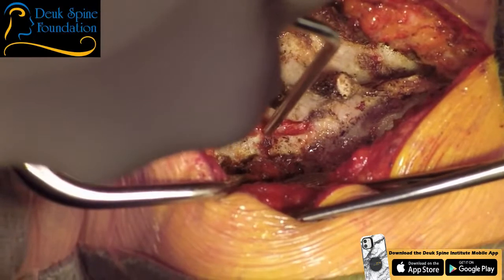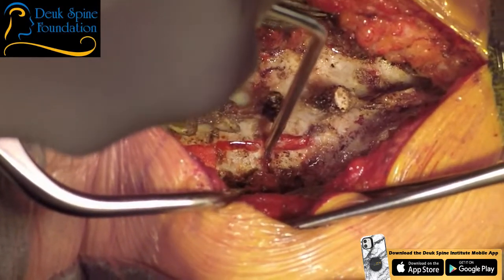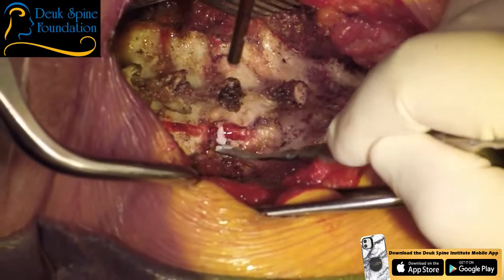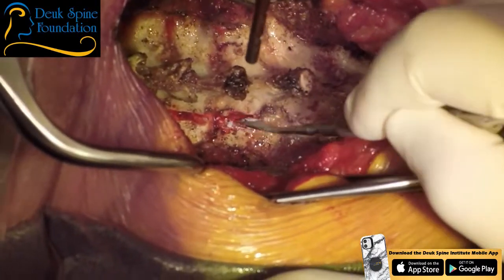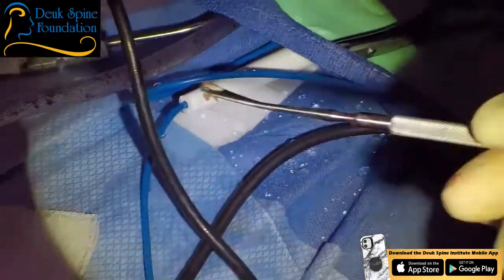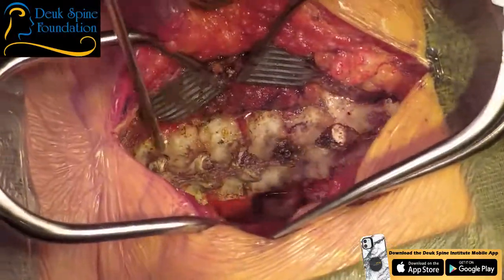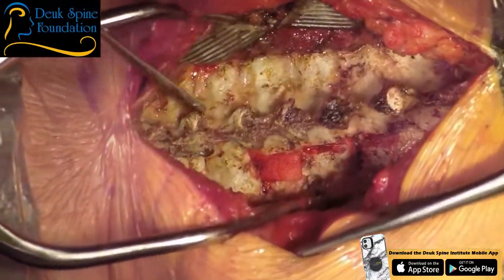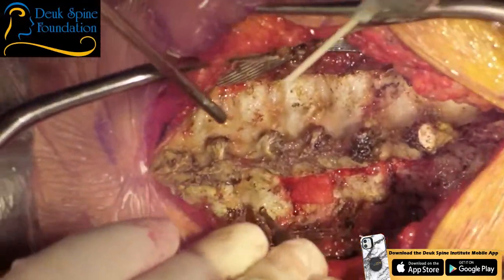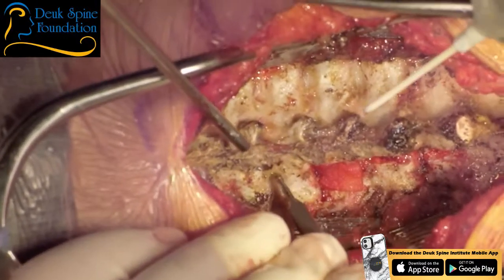What should we do there? Looks like a little bone wax maybe. Looks like the diploic bone perhaps. What is this, a Freer, Luis? Yes, sir. We use a Freer. They call it the dental tool, right? Isn't that the dental tool? Yes, sir. All right. Gonna belly up to the bar here, and we'll get the next osteotomy done.